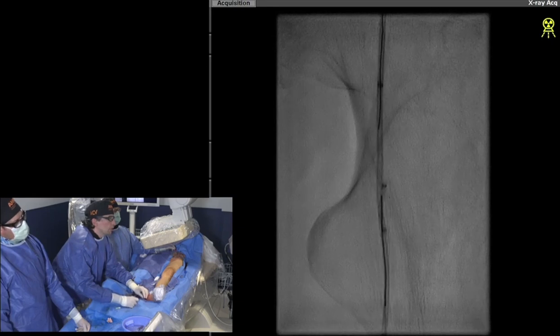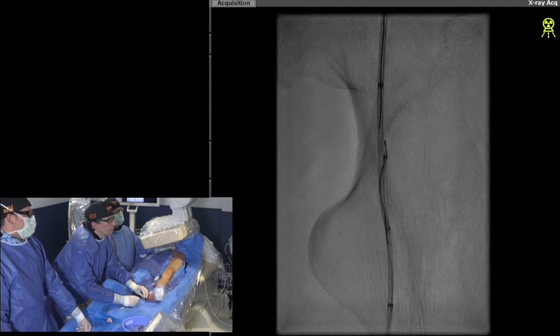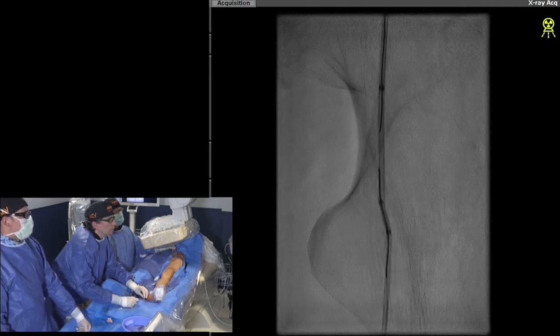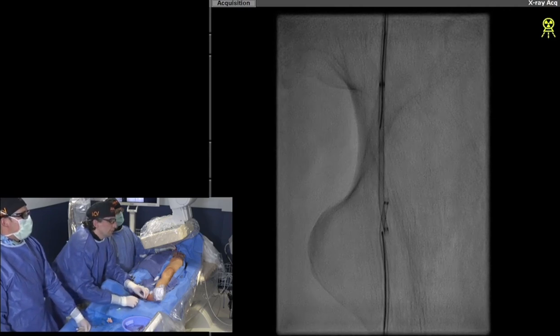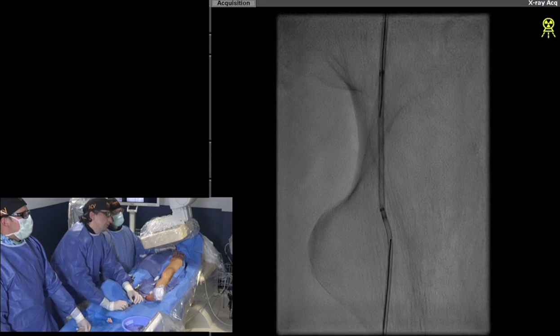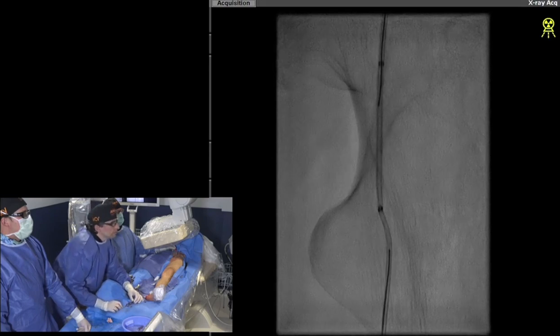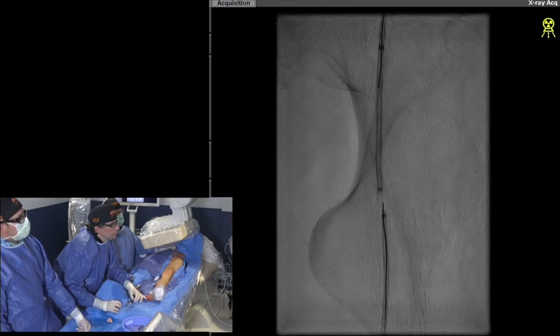Either do a big rotation up and below without the wires, or use ultrasound. We're just trying to break the plane — keep going, it's kind of breaking free. I think we're in the same plane now. Pull back the Navi. Can I have an 014 Command please? The catheter coming from above needs to turn to our left — have them both go lateral.